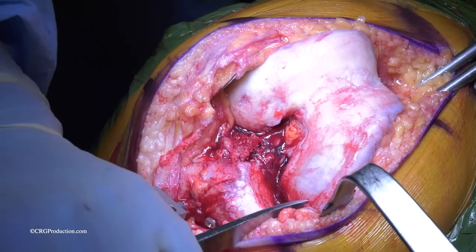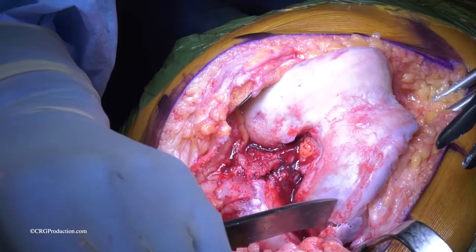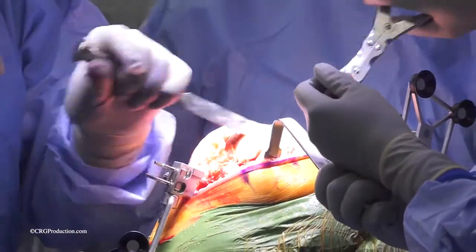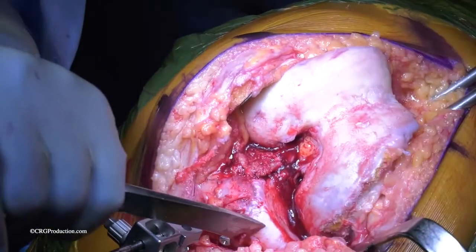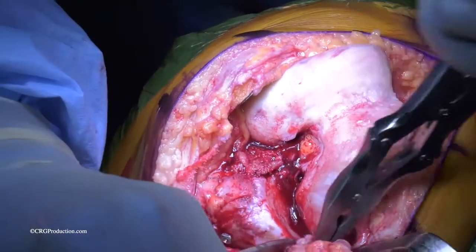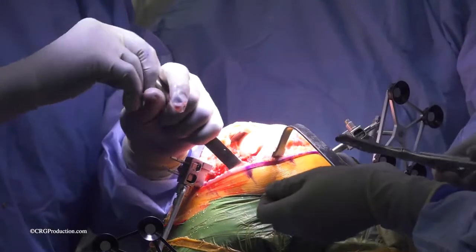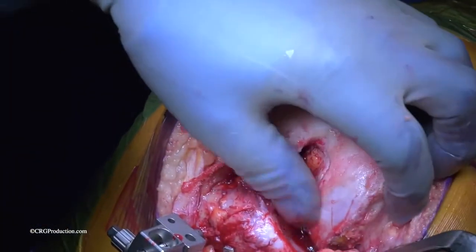You'll see some large spurs of bone. These are now being removed from the inside part of the knee with a sharp chisel called an osteotome, a curved osteotome. They are in turn removed by a rongeur. On the top of the shin bone, further bone spurs or osteophytes are removed as well. A soft tissue dissection is done with the osteotome around the corner of the knee.